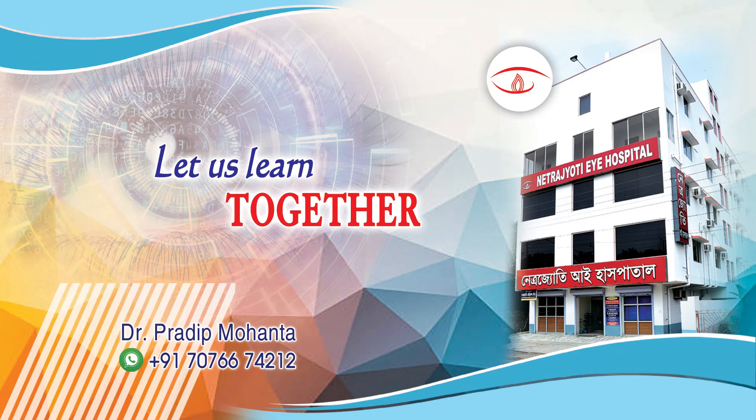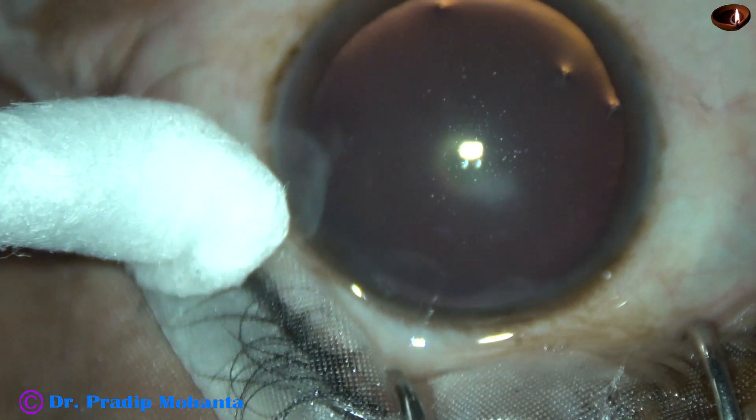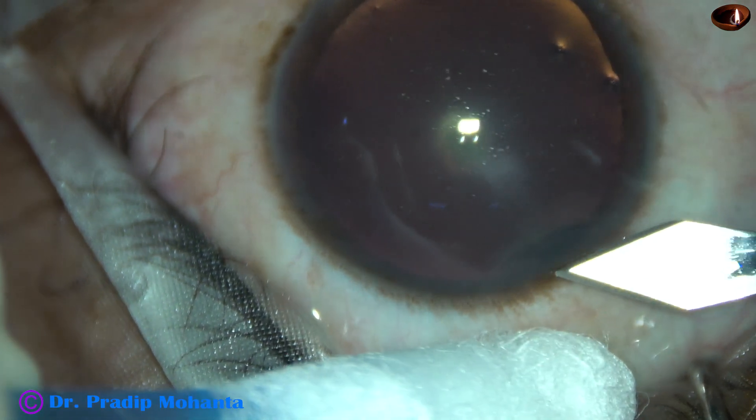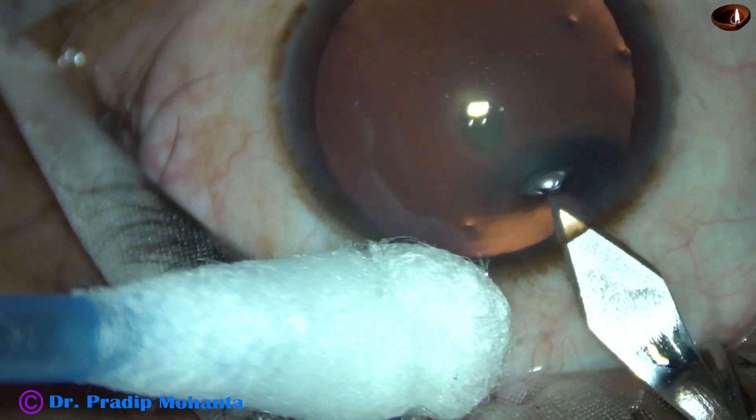Friends, welcome to my workplace at Ranaghat, West Bengal, India. This cataract is likely to be a posterior subcapsular cataract, but we cannot rule out the possibility of a posterior polar cataract.